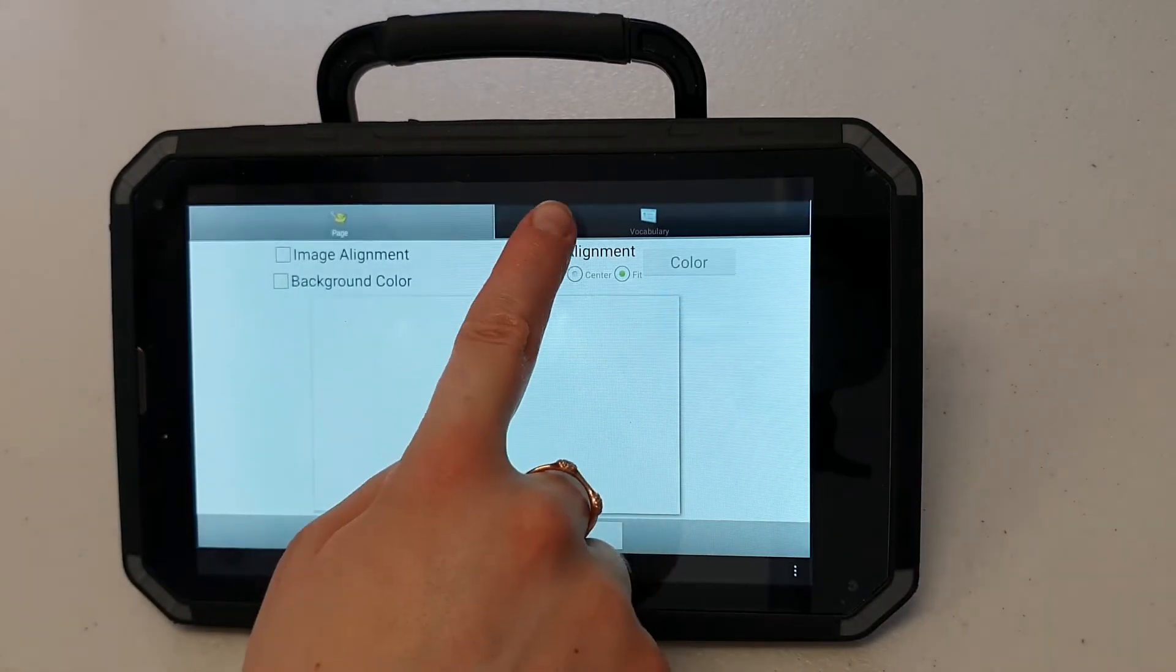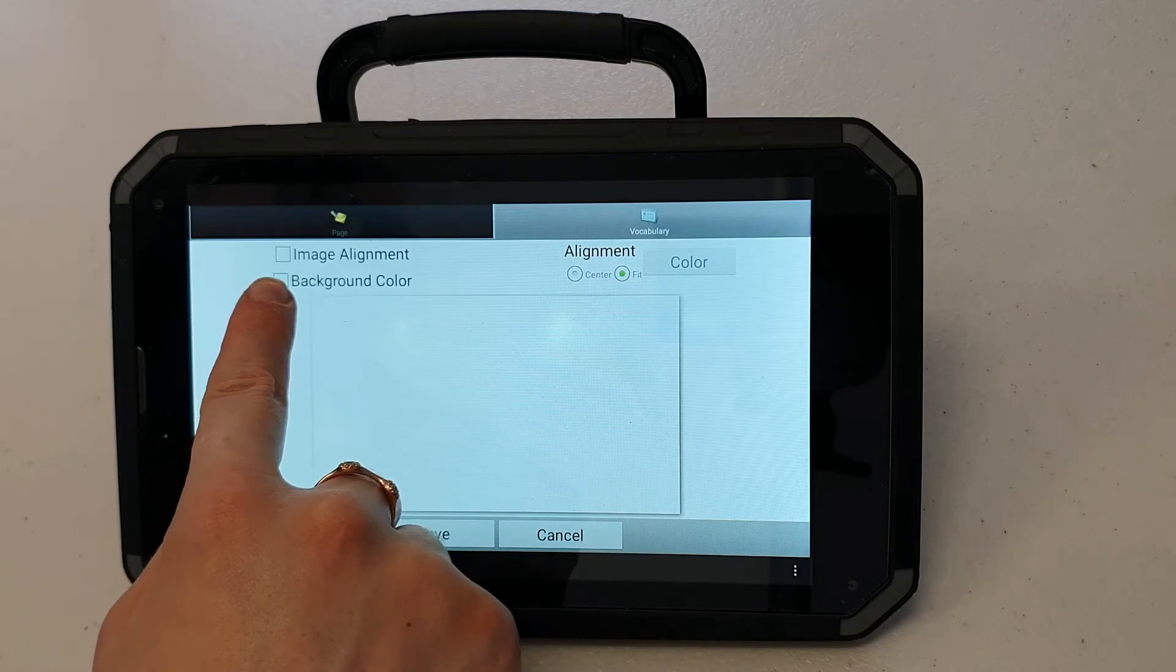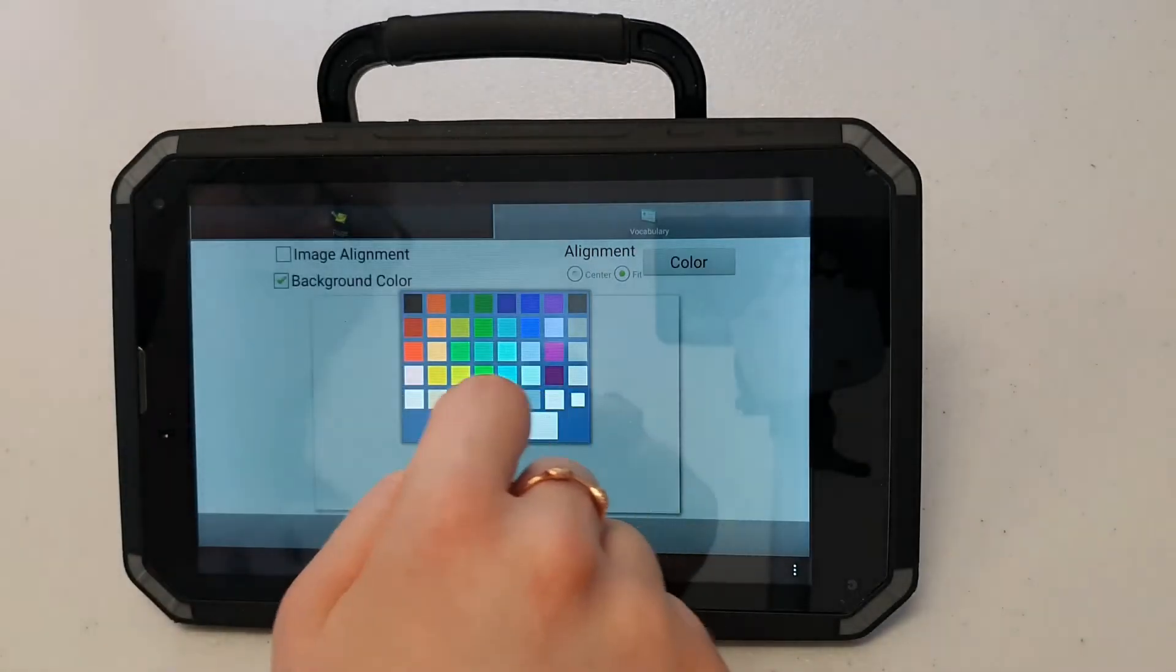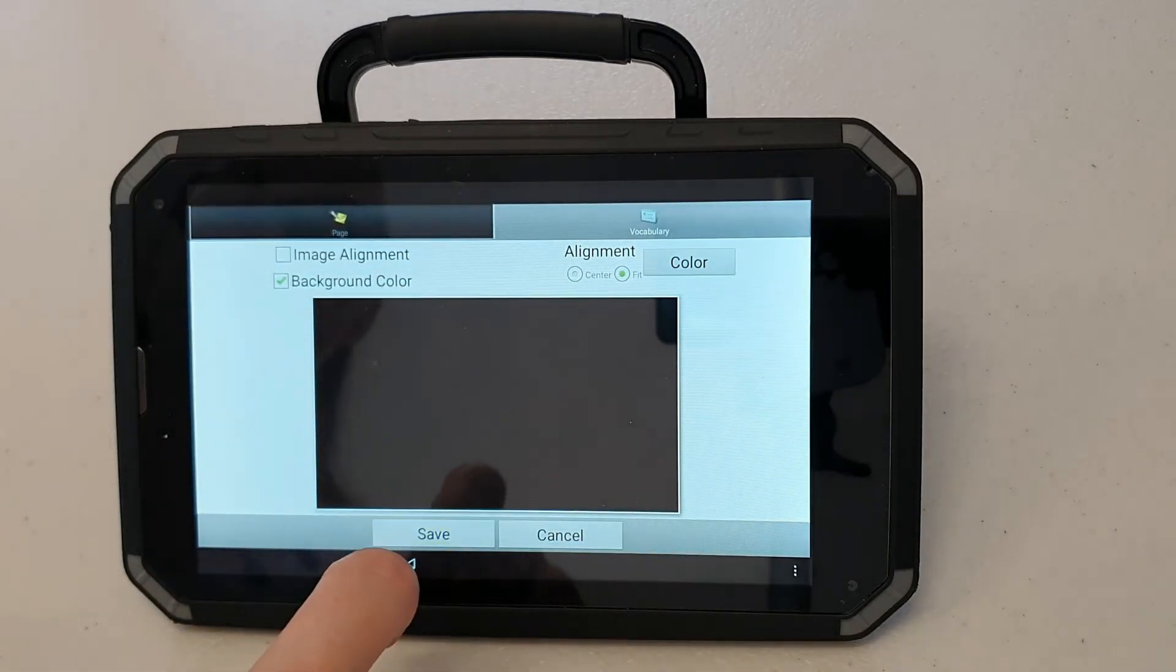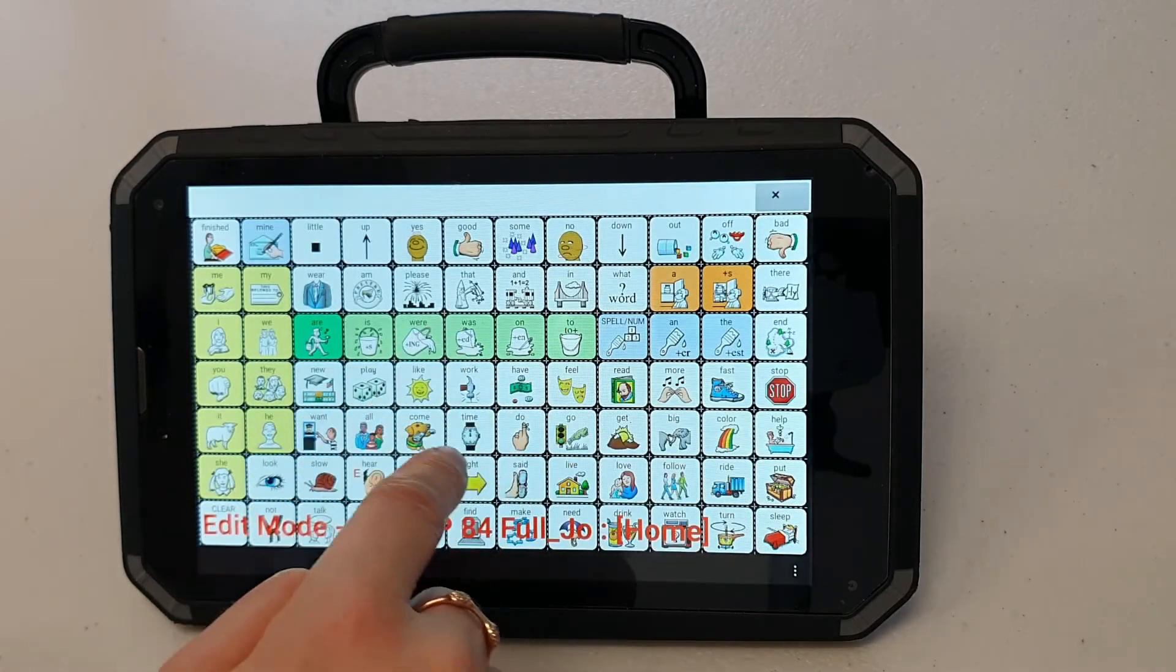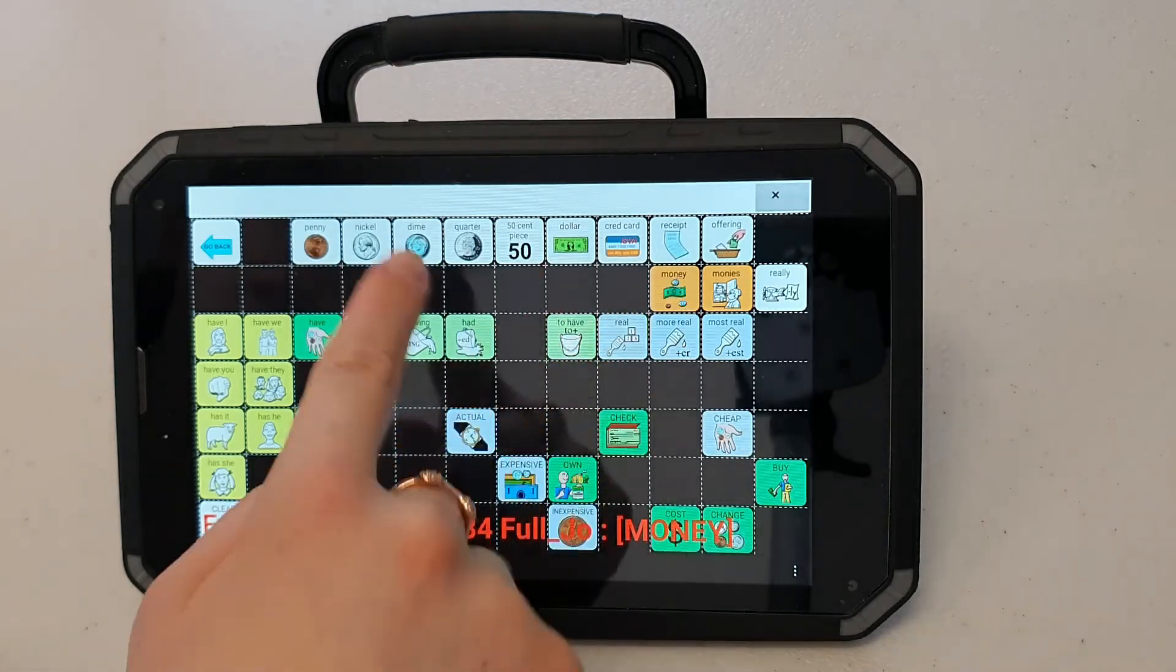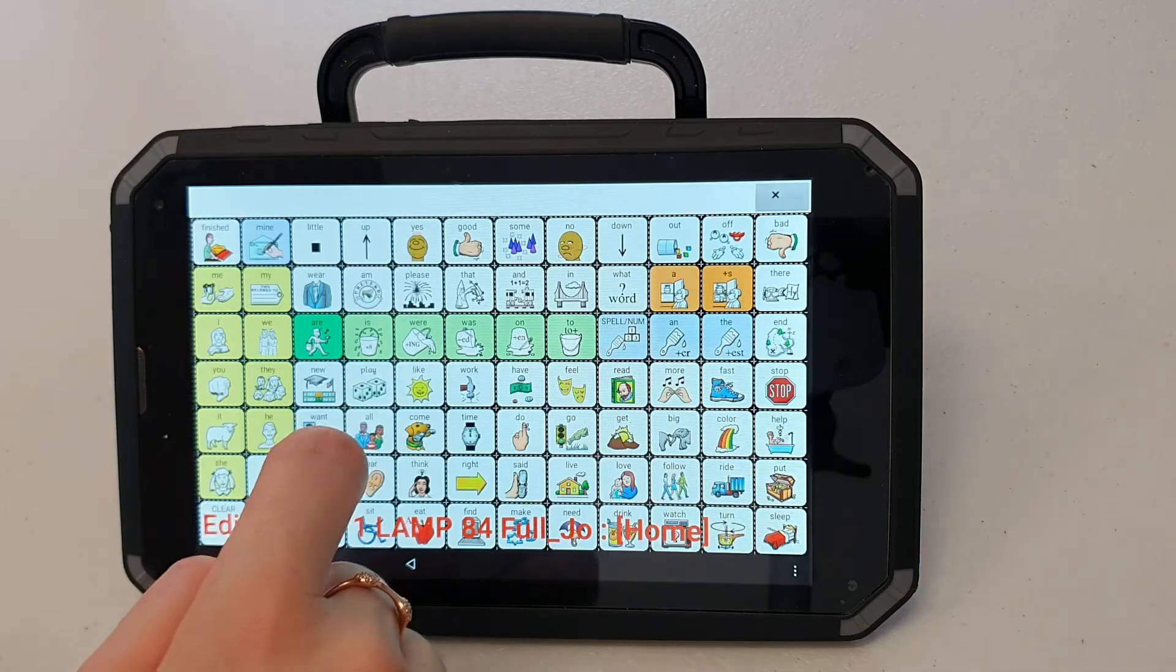Press vocabulary, background color, color, and selecting the black square up here. I'll press save. So as you can see here my background has now turned black. It looks quite nice when I have fewer icons on the page they'll stand out a bit more.